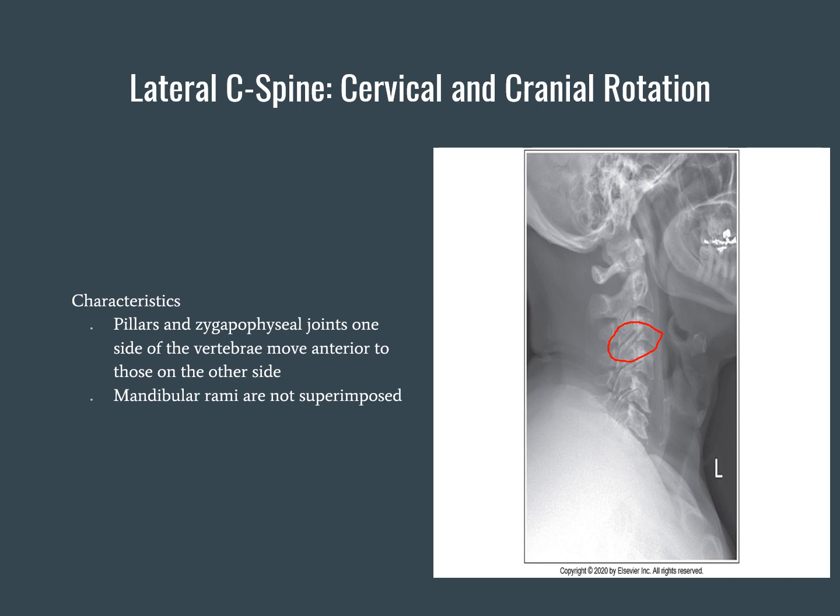Align that interpupillary line perpendicular to the IR. Position those shoulders on the same horizontal plane and elevate that chin so the acanthomeatal line is parallel with the floor.